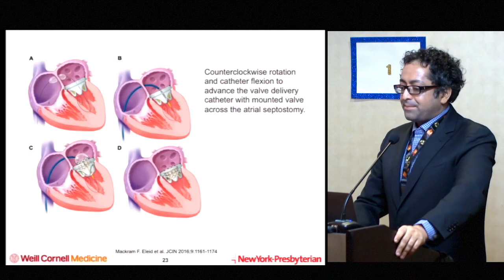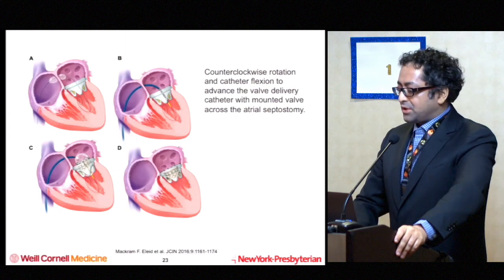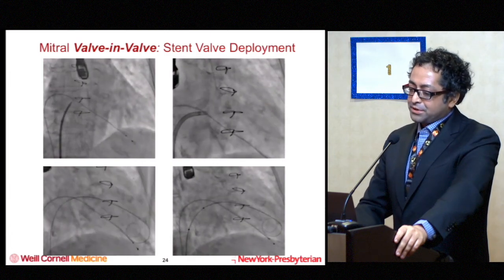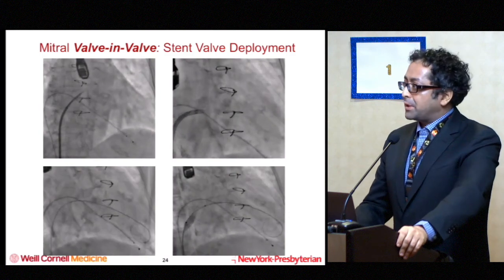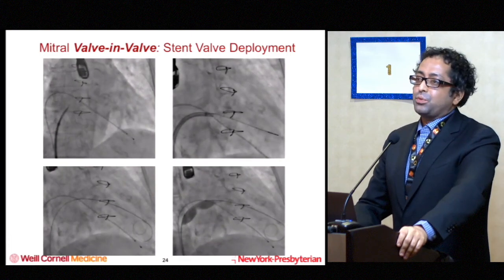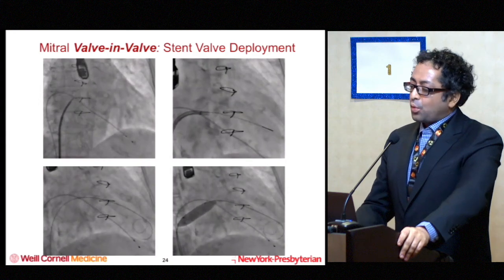You go across the septum, you create a septal window, and then you bring the transcatheter valve and deploy with rapid pacing. So in this particular case, we're going across in picture 1 of the transeptal, usually just using whatever you feel comfortable with. We heard all the transeptal techniques earlier. Switching over, typically it's an Agilis sheath that gives you an easier way to just go through and direct towards the left ventricle, get a wire in place.